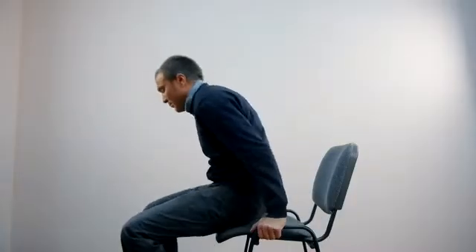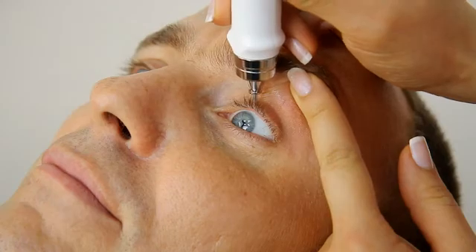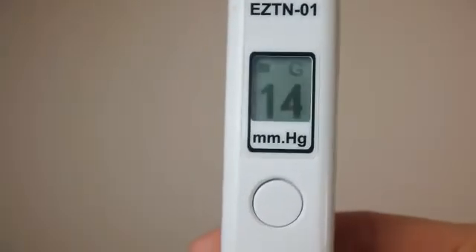The proper patient's position is ensured. The head tilted back horizontally, the gaze fixed upon the test object at an angle of 45 degrees. For accuracy self-check, do the measuring procedure again for the second and third time.